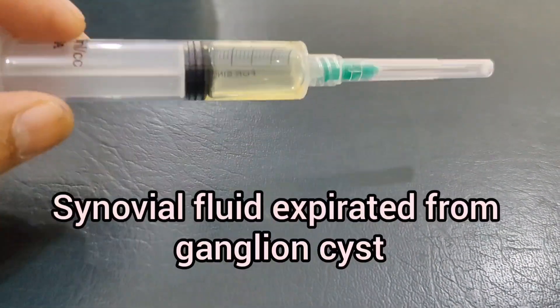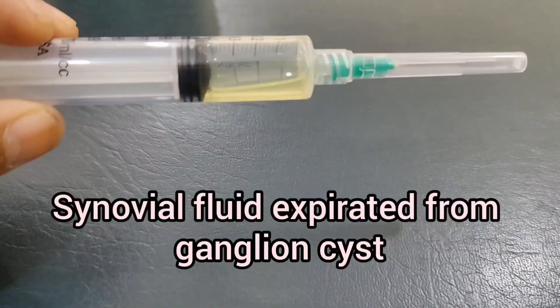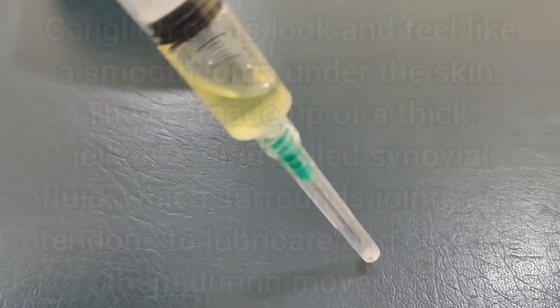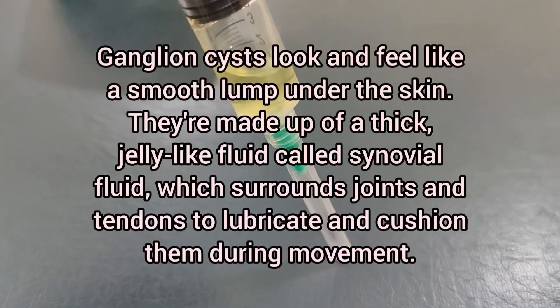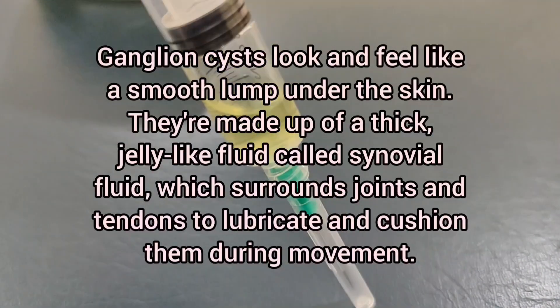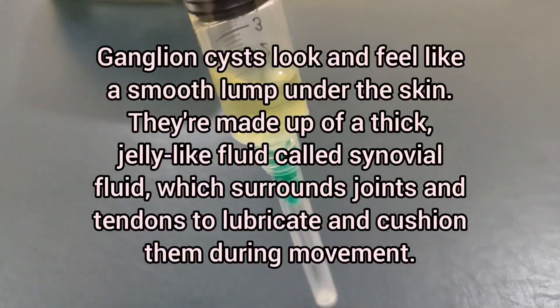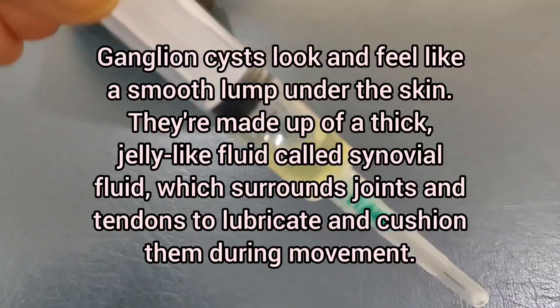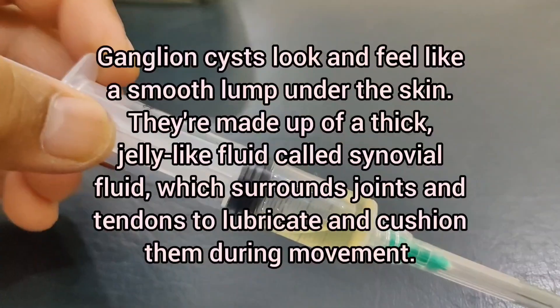In this syringe, you can see oily fluid called synovial fluid. It was aspirated from the swelling around the ankle of an old diabetic patient.